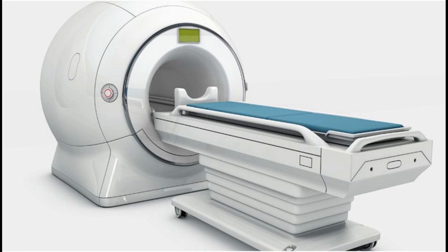Cardiac MRI is complementary to other imaging techniques, such as echocardiography, cardiac CT, and nuclear medicine. It can be used to assess the structure and the function of the heart. Its applications include assessment of myocardial ischemia and viability, cardiomyopathies, myocarditis, iron overload, vascular diseases, and congenital heart disease.